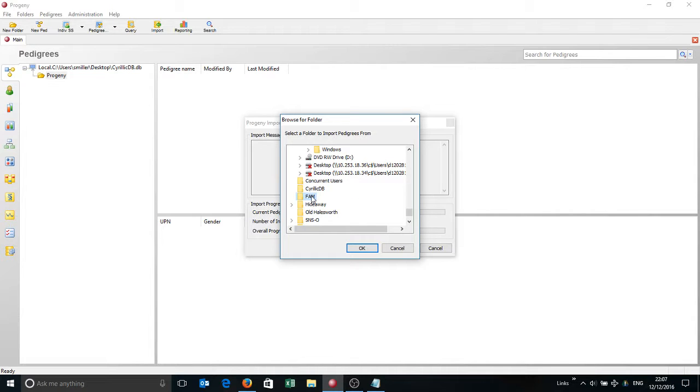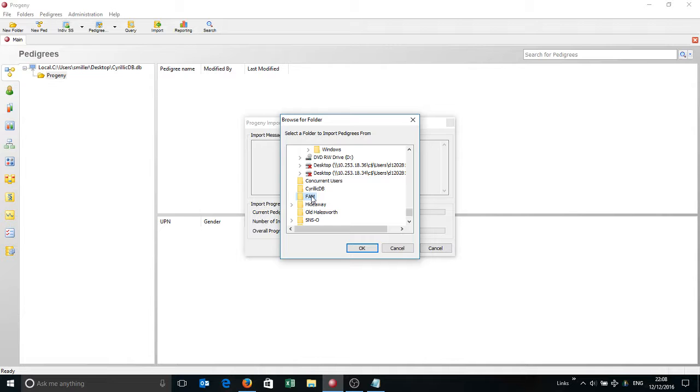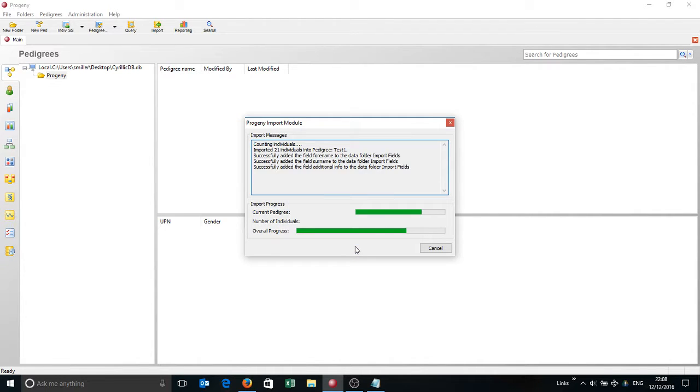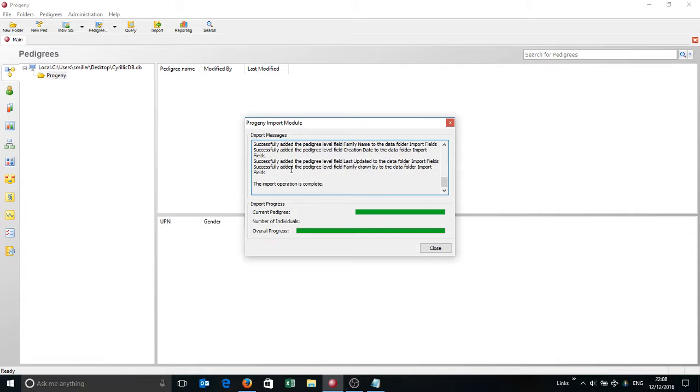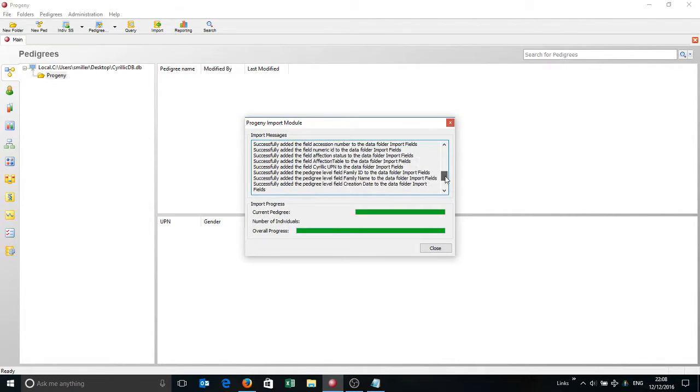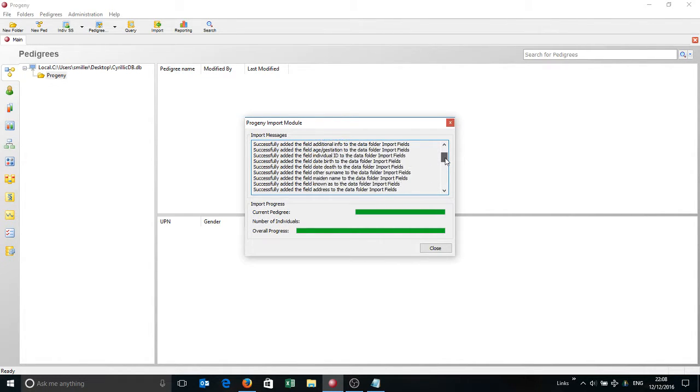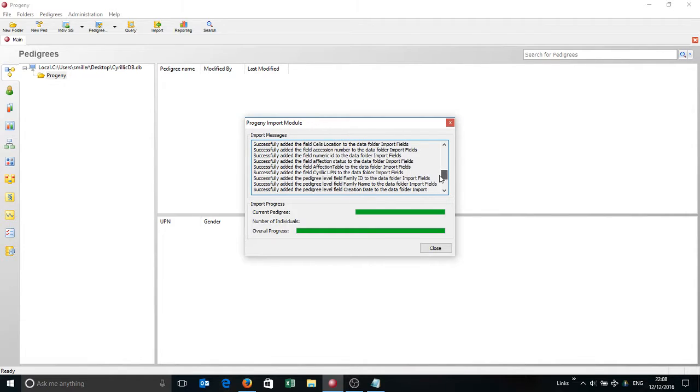You can have one or many FAM files in that folder, in my case I've got a single FAM file. I've started with a completely blank database today so I can show you what Progeny will do the first time you import some FAM files. So I'm going to click OK and you'll see what Progeny is doing here is not only importing the Pedigree structure, it's also creating all of these fields with the associated data that comes in from Cyrillic.